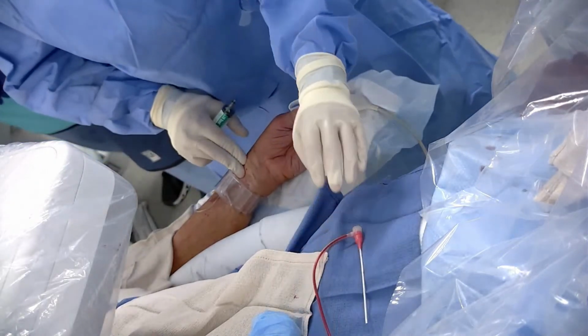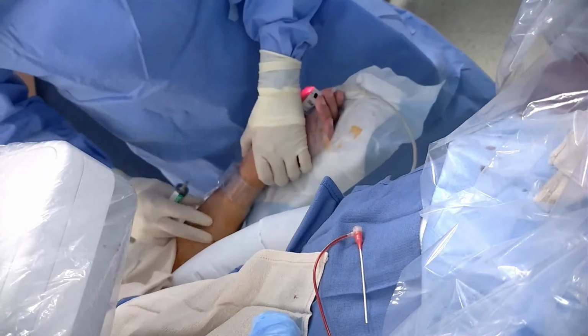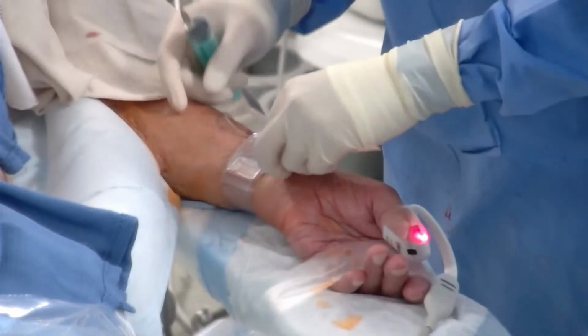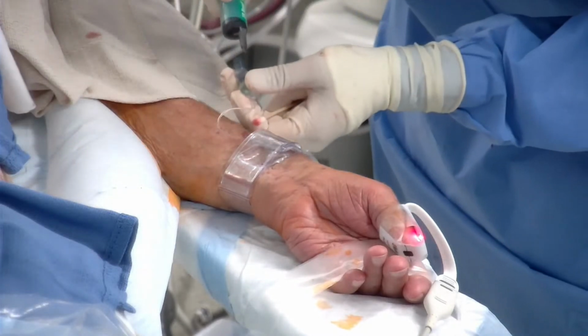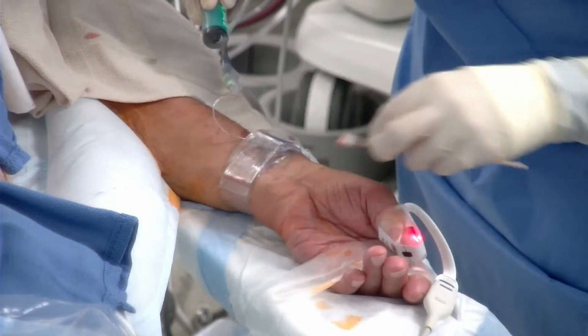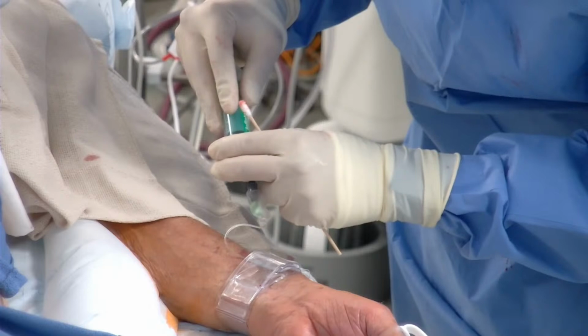It's a little hard to see. Sometimes when blood gets underneath there, it's hard to tell exactly if it's bleeding or not. So he's just cleaning underneath with a Q-tip here. Now he's going to slowly let out a little bit of air until he sees blood coming out of the arteriotomy, and then he'll put in 1 cc more. And we'll leave it up.